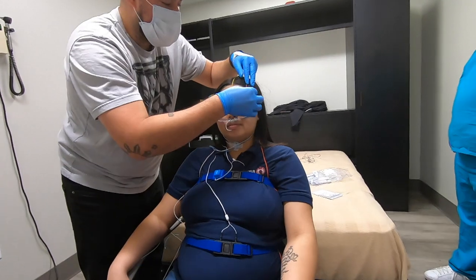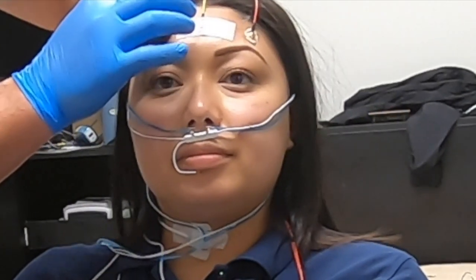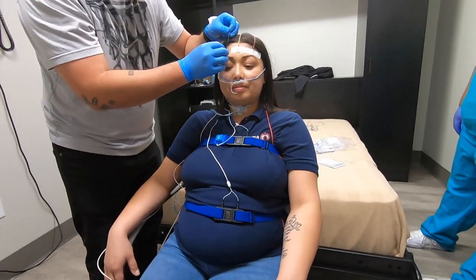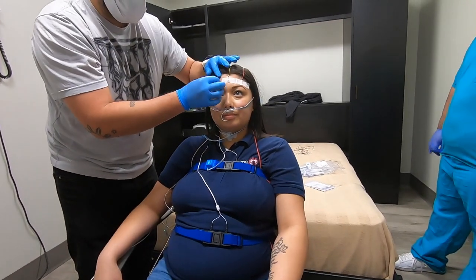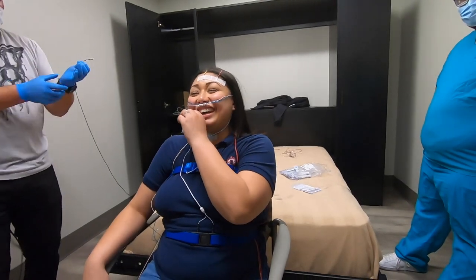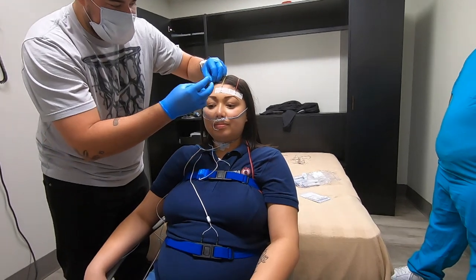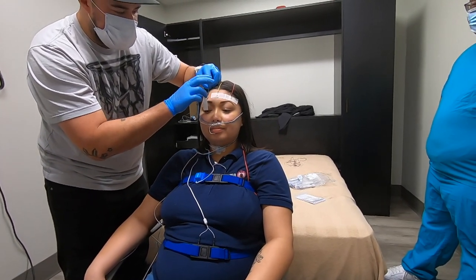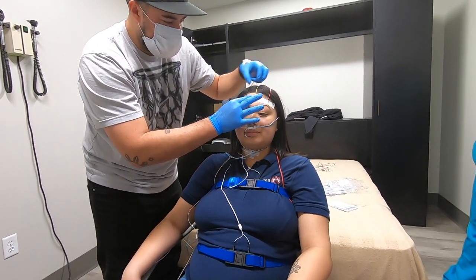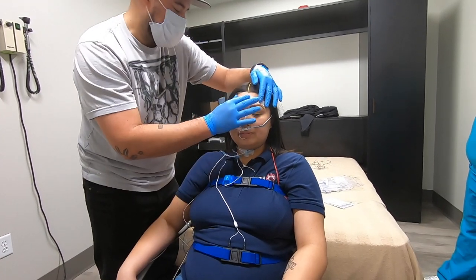In the nose we have a thermistor — that's the white thing coming down in front of her nose. And then we have a cannula going up into the nose; those pick up nasal pressure. The thermistor picks up heat exchange: when you breathe in it gets colder, when you breathe out it gets hot. That creates a parabolic signal and you can see breathing. The nasal pressure is kind of the same thing but uses pressure instead — you get a nasal flow showing what the breathing pattern looks like.